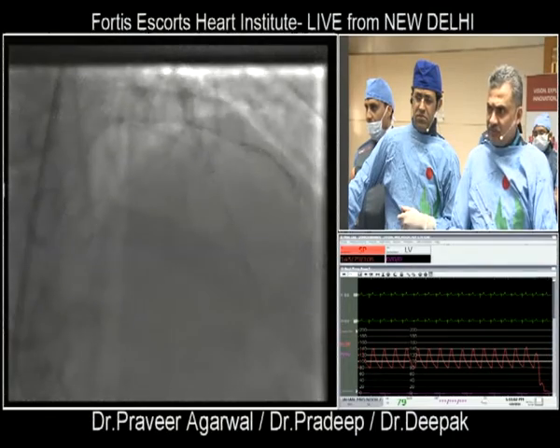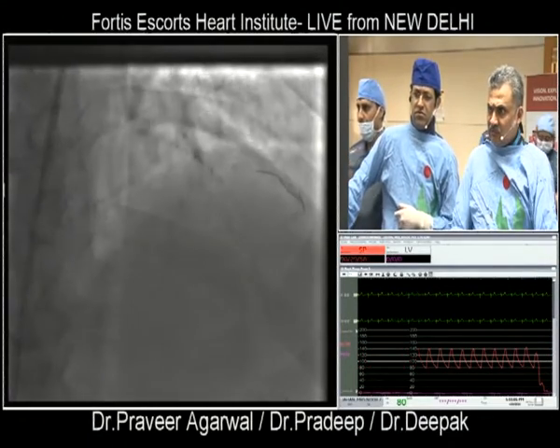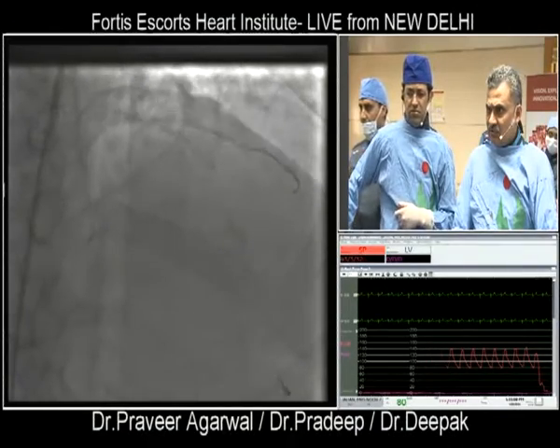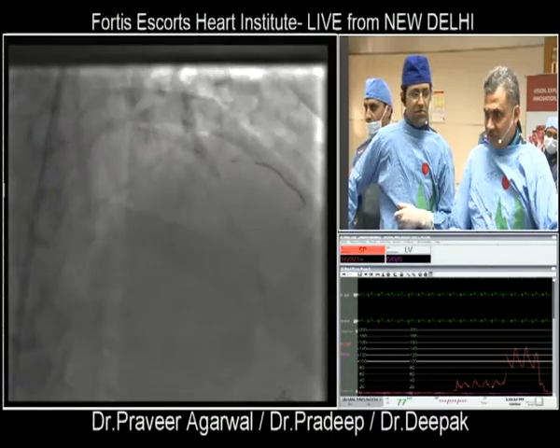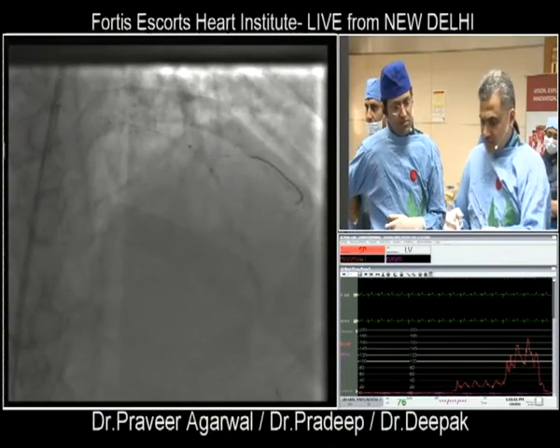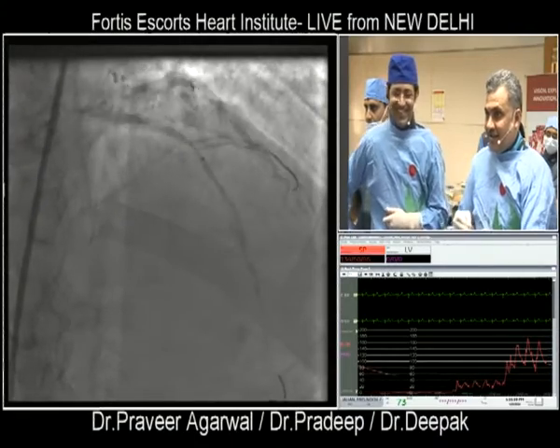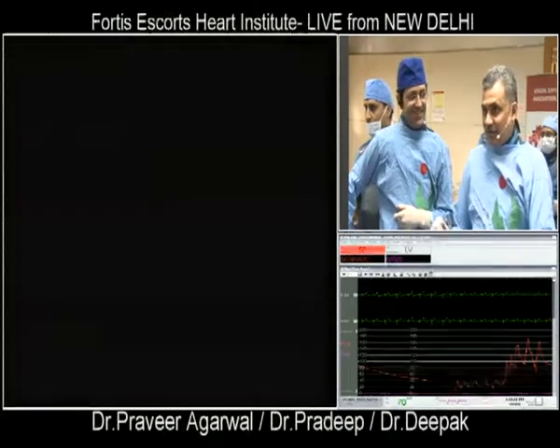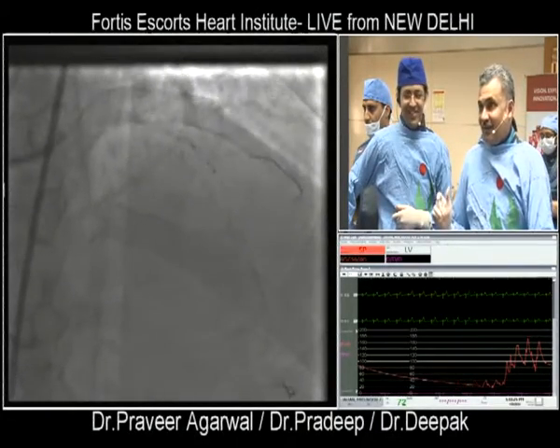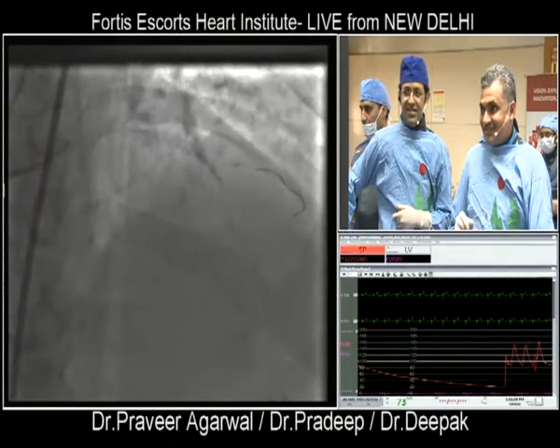We are just commenting that we like a lot the way you let the balloon inflate with the one, one and a half, two. We like it a lot. We don't do it, but I think I will use it if you allow me. Yeah, be gentle to arteries, they will be gentle to you. Go up, one, two. I will quote you, don't worry, I will quote you.